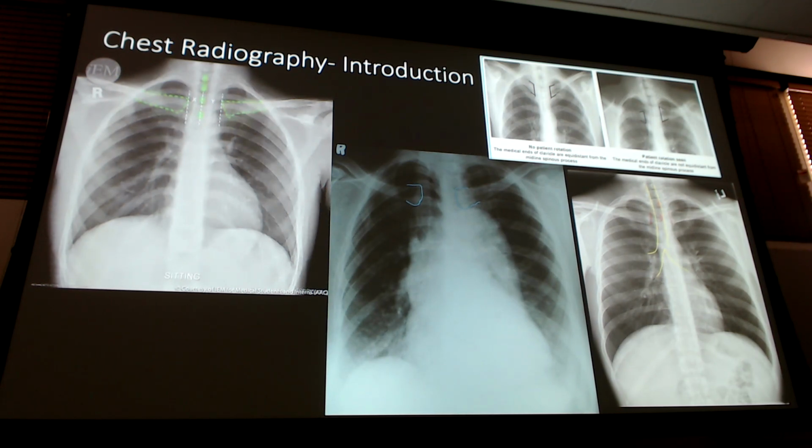It might look like a huge right atrium, because when I rotate, more of the right atrium is now being projected out. Or left ventricle, more of the left ventricle is being projected out. It can throw off your whole mediastinum evaluation if you are rotated too much, which is why this is one of the things you have to make sure of, okay, it looks like everything is good. That's why it's one of the techniques of an adequate x-ray.